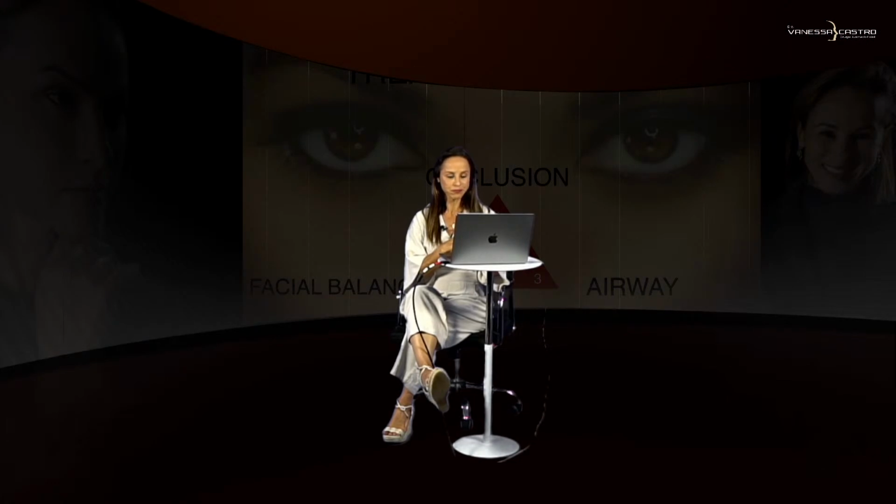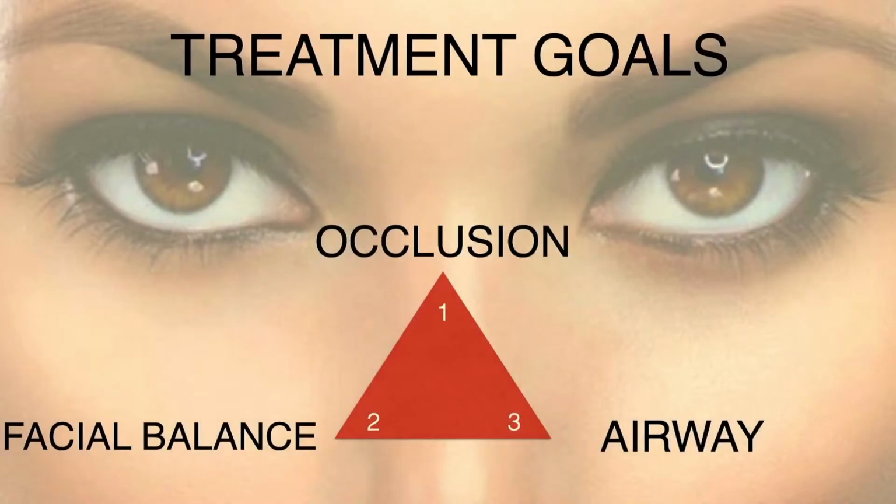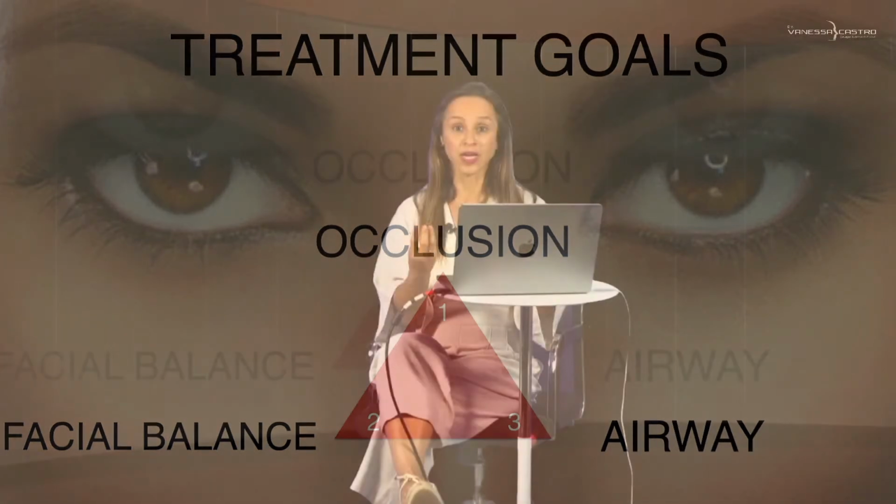So talking and returning here for my treatment goals, we need to get these 3 points in the patient: a good improvement of the airway, the best occlusion that I can get, and facial balance. I need to think about it every time.